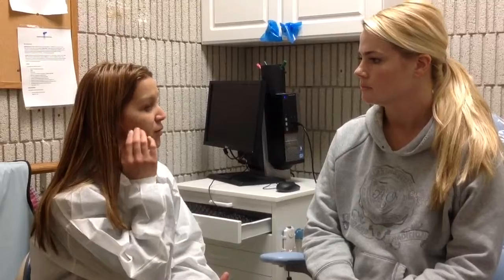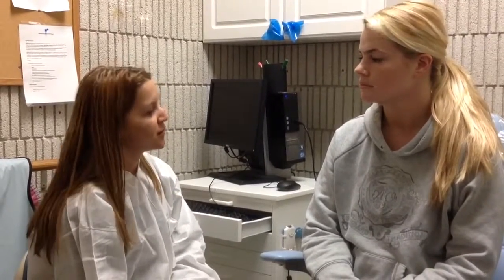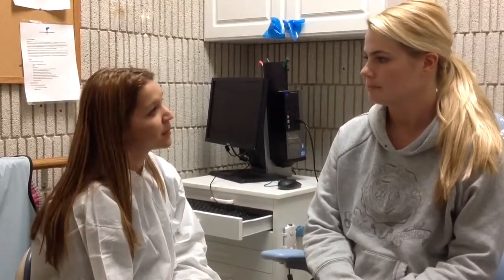I heard you had a really bad ski accident. I hope everything's okay. So we just want to make sure that there's no fracture or trauma to the jaw, the mandible area. A good way to detect that would be to take a panoramic x-ray, and it's very simple. It will take about 45 seconds, and we'll be able to see the upper and lower jaws for any fractures or problems with that area. Is that okay?